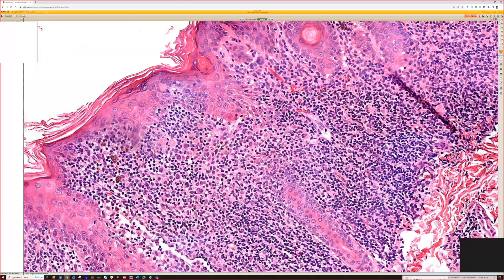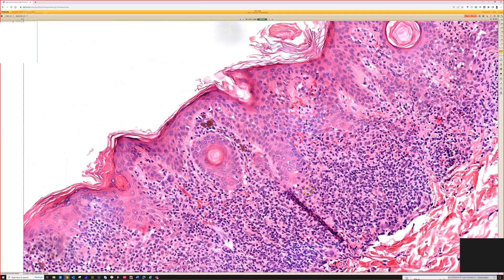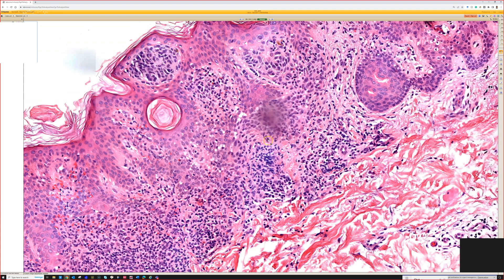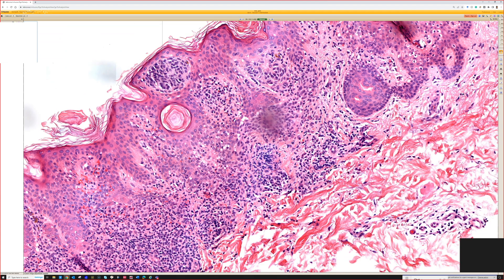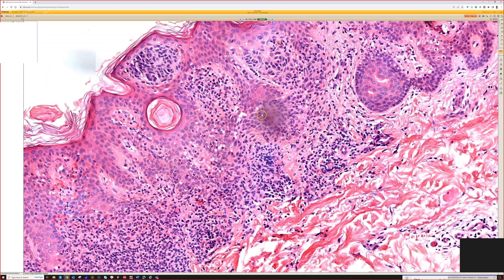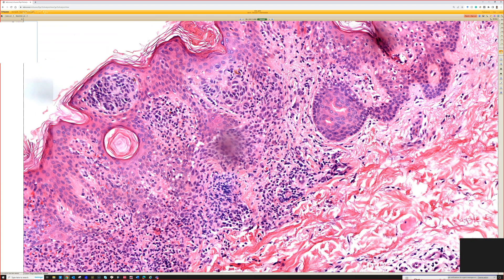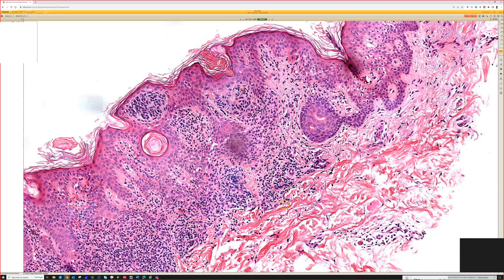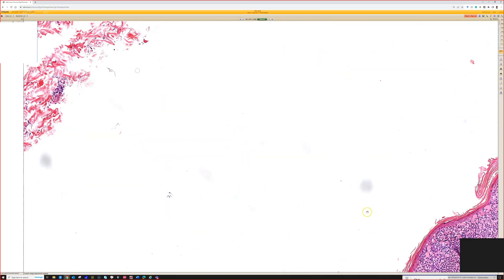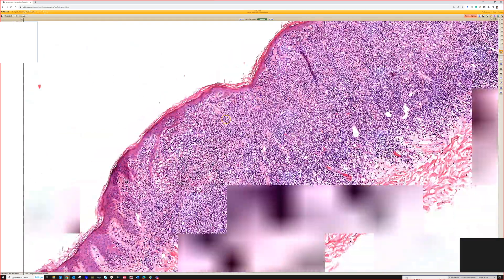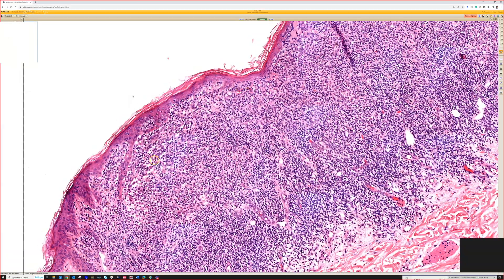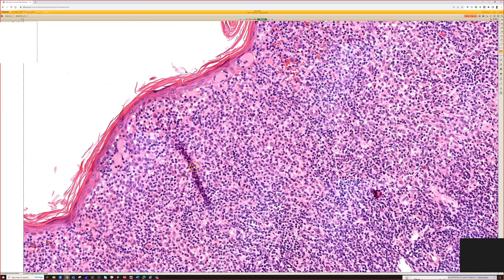Here you can see some nests and melanocytes a little better. Almost always when I see halo nevi they have plump cells and often have bridging. If you took the inflammation away, they'd look almost like a moderately atypical dysplastic nevus. Some people don't grade dysplastic nevi for understandable reasons, but moderate plump atypia in these does not worry me at all. I'm not sure if the inflammation causes it or if it's because young people generally have larger melanocytes in their nevi, but it's a feature that's almost always present.